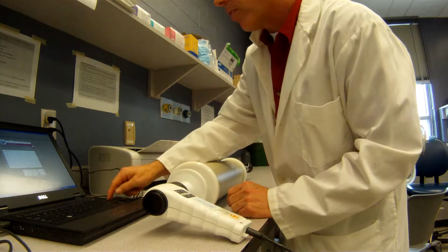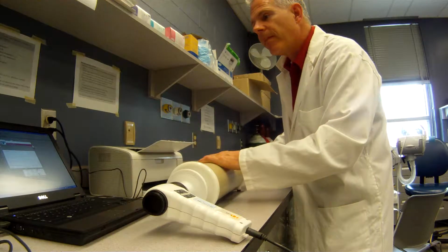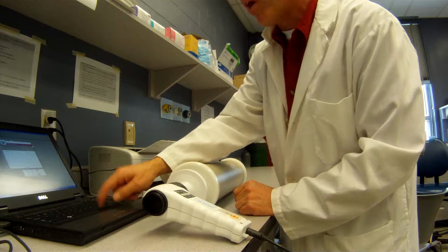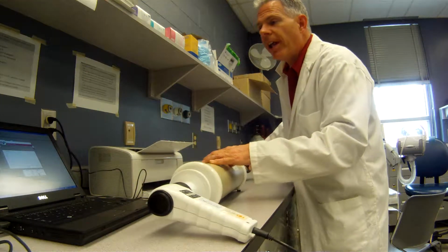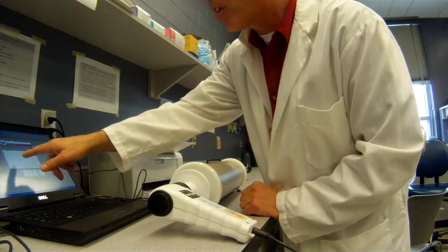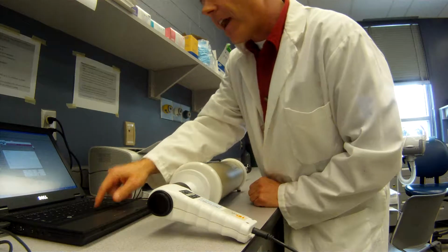All right, so I go Continue, and it starts doing that. I pushed it in the wrong way, so I hit the space bar. That's no problem, and it'll come back now. So I'm going to pull back quickly and try to get my flow rate as close to that dotted line as I can. I got it pretty close. So it says Continue. That was inspiration, and now we're going to do it for exhalation.